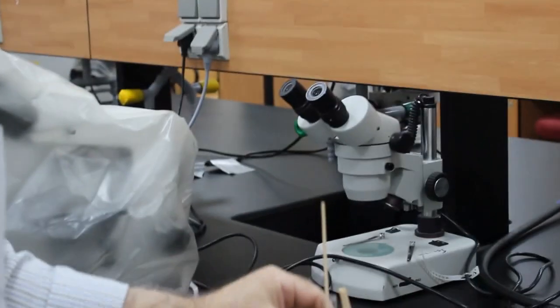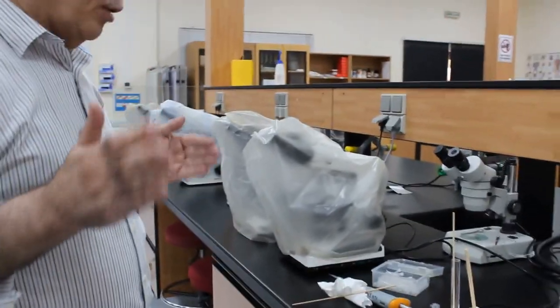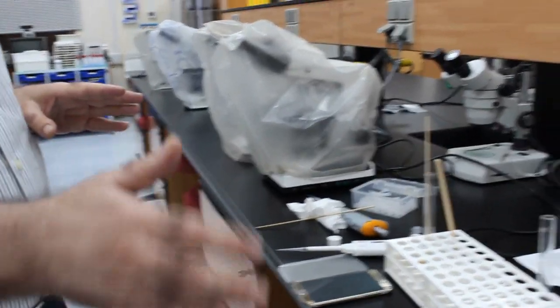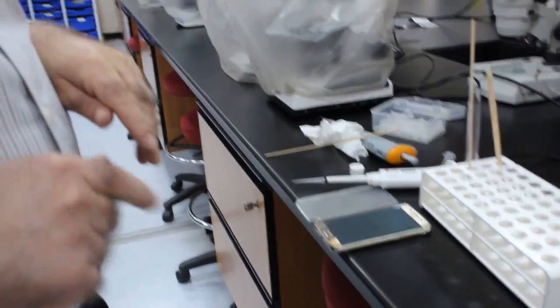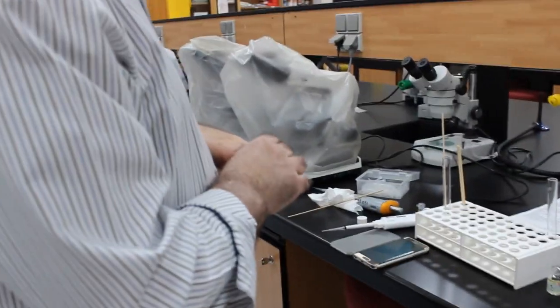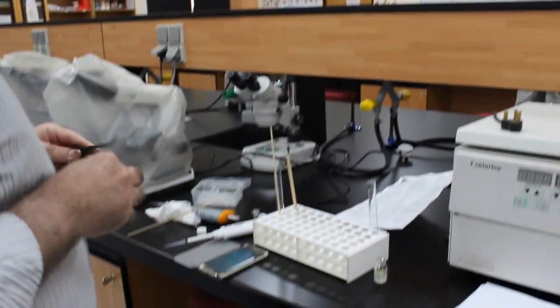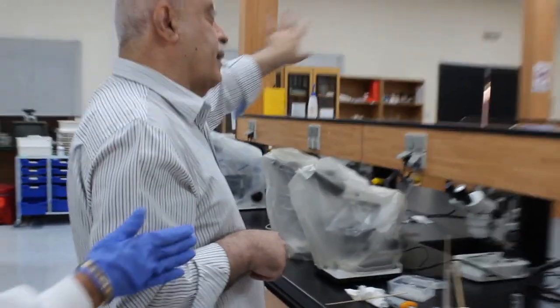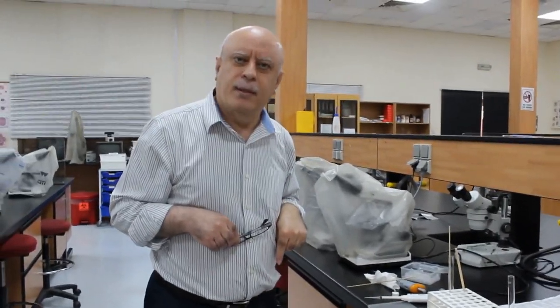It clotted at 12.0 seconds, and anything between 11.0 to 12.5 is normal. So there is no reason, for this patient that we just drew, I'm not going to tell you the name of the patient, the PT is normal. It means all the clotting factors in the extrinsic pathway are normal. That doesn't tell us much about the other clotting factors. This we're going to do next week. Thank you very much.